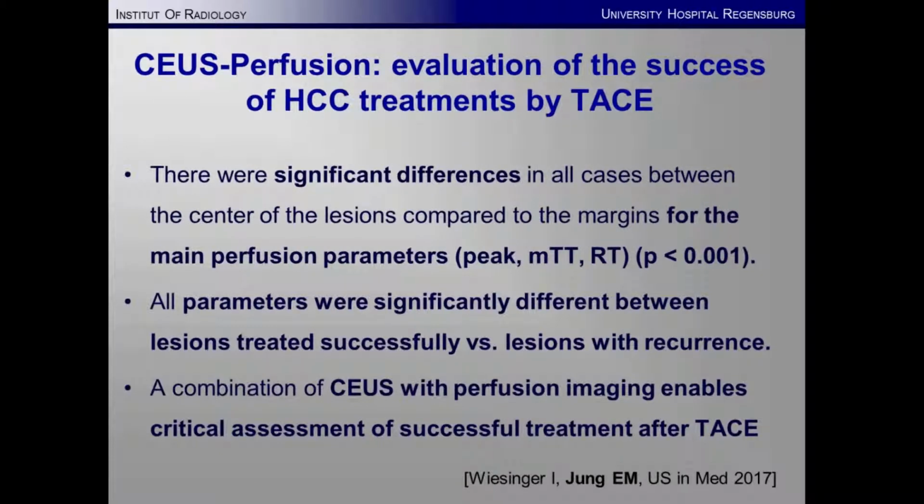It means we could show that we have a significant difference for mean transit time, for peak enhancement, wash-in rate, if we are successful. And we have a significant difference if we know it is a complete devascularization, or we have a little bit of tumor at the margin of the treated lesion. So we use these parameters for more precise follow-up.